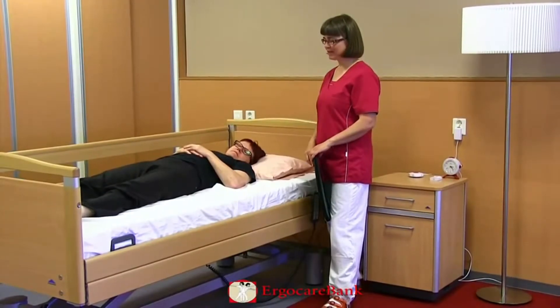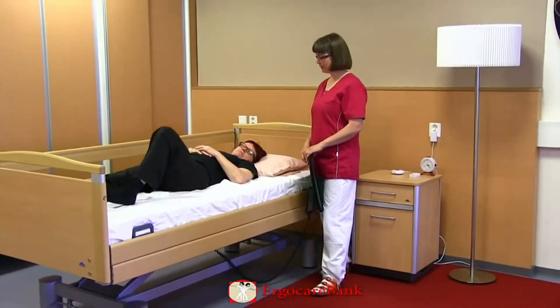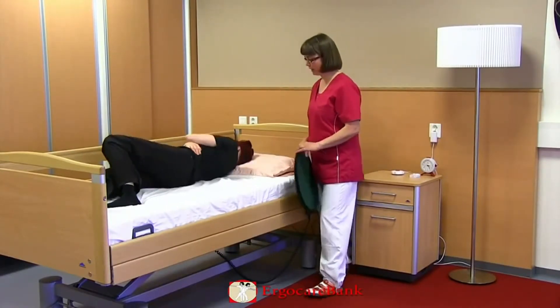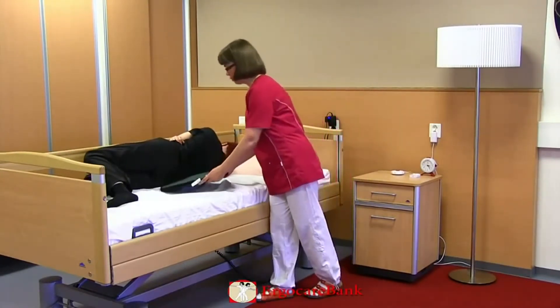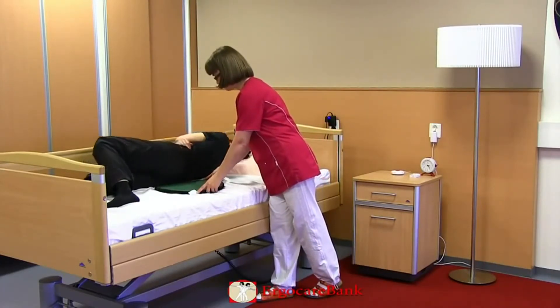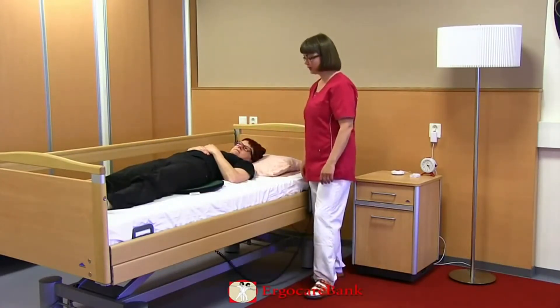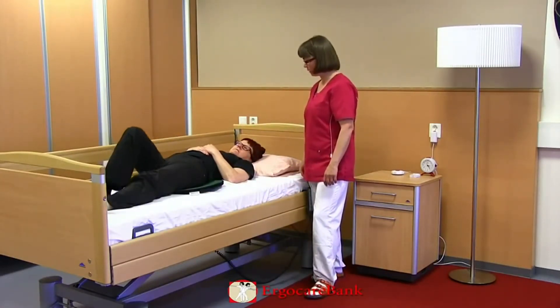The staff member asks Amanda to bend her left leg and roll over to her right side. She then places a turning disc so that when Amanda rolls back, the disc is under her bottom. Amanda is instructed to bend her right leg, place her arm across her body, and roll over.